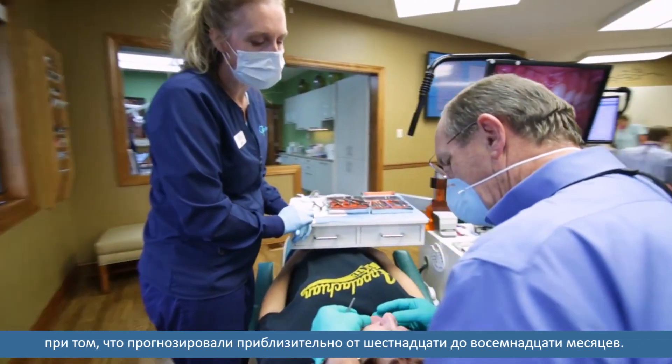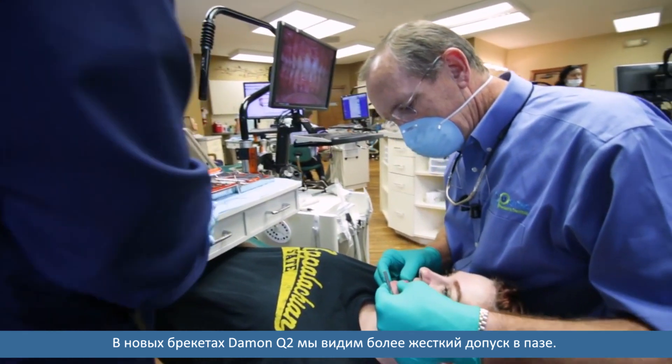We just had a mom in today — her daughter finished at 10 months of treatment when we predicted approximately 16 to 18 months. With the Q2 bracket, we've been able to see that tighter tolerance in that slot.